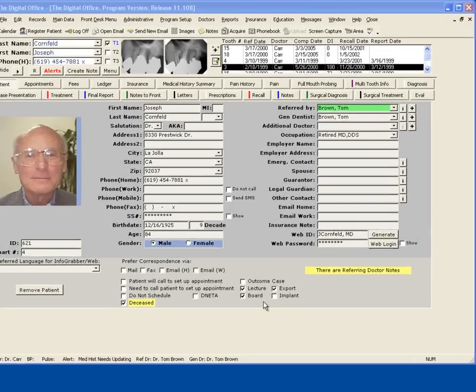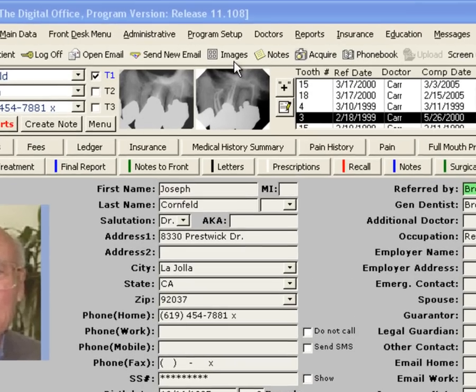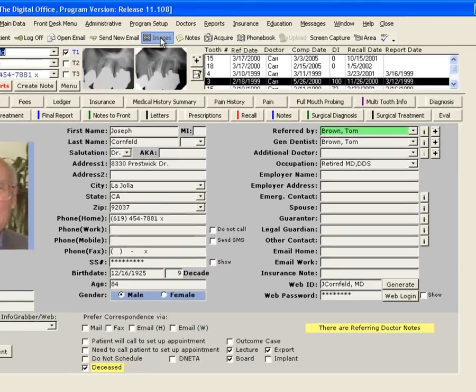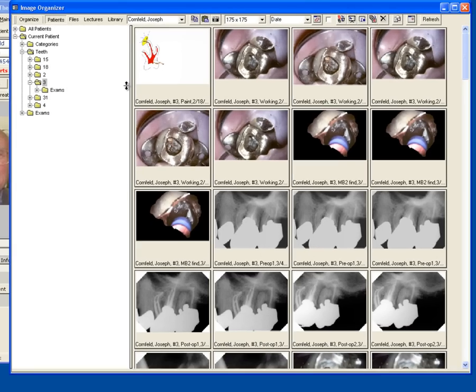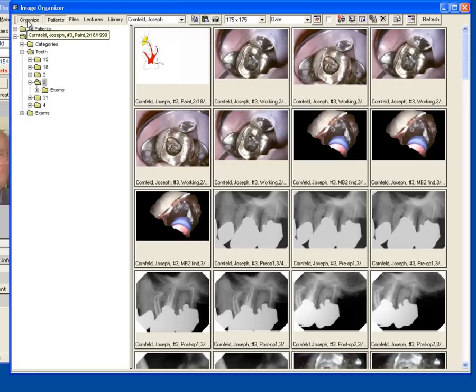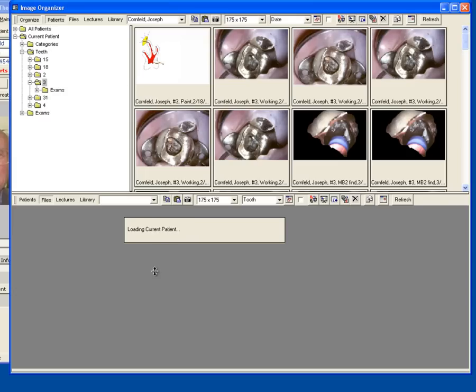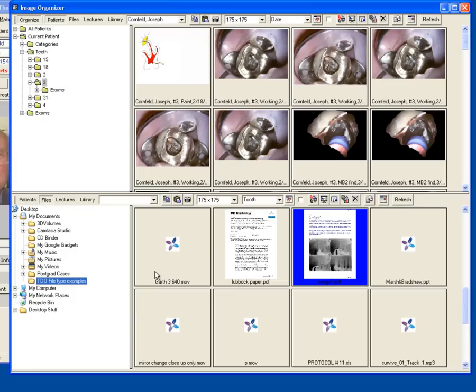Let's take a look at this. I'm going to click my Images button on my top toolbar. This opens my Image Organizer to my current patient's file. I'm going to click the Organize button at the top. This gives me two different window panes.